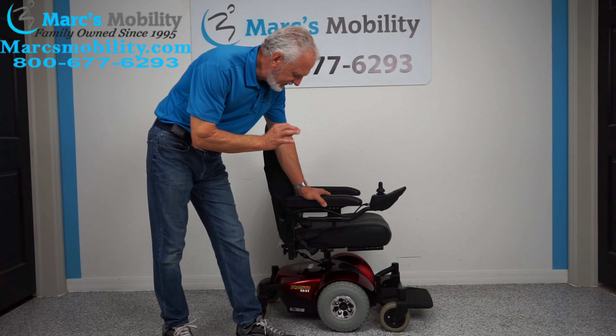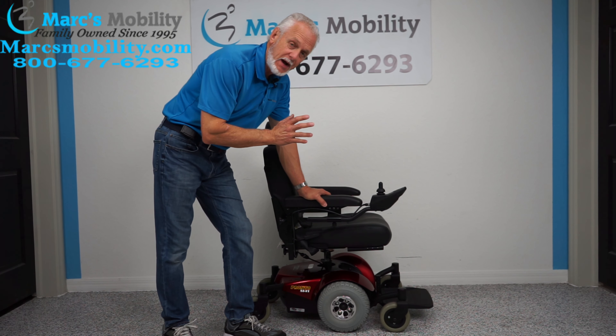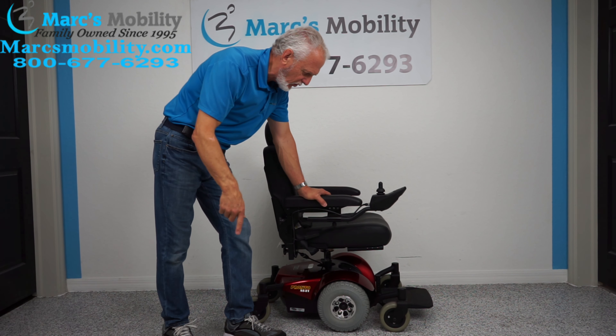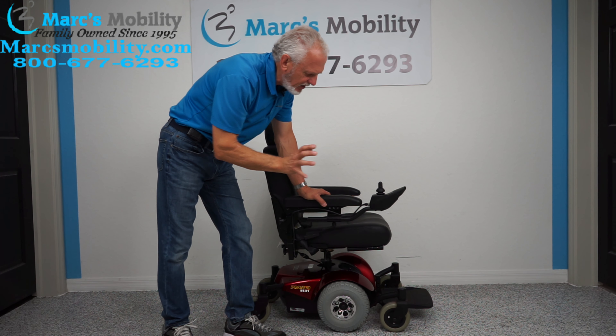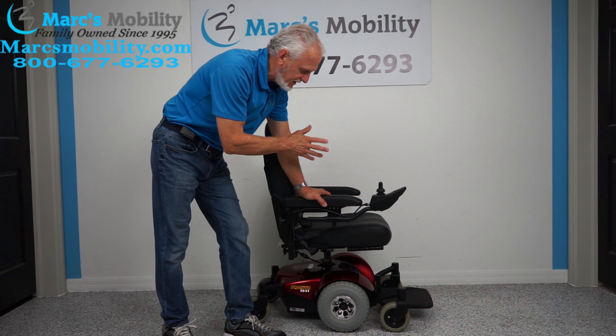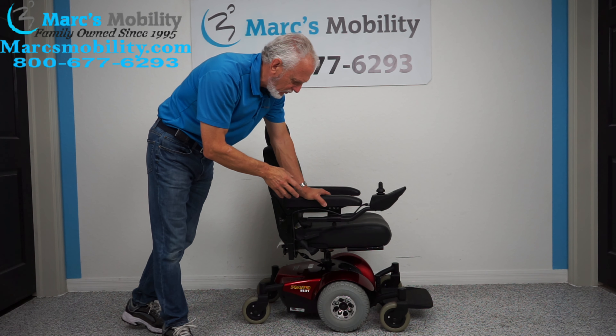Hi folks, we have here an Invacare Pronto M41. This is a small power chair, so if you're looking for a small power chair with a really small turning radius and a foot plate that does not stick out forward too much, and a decent size seat, this would be one you need to pay attention to. This is the Invacare Pronto M41.